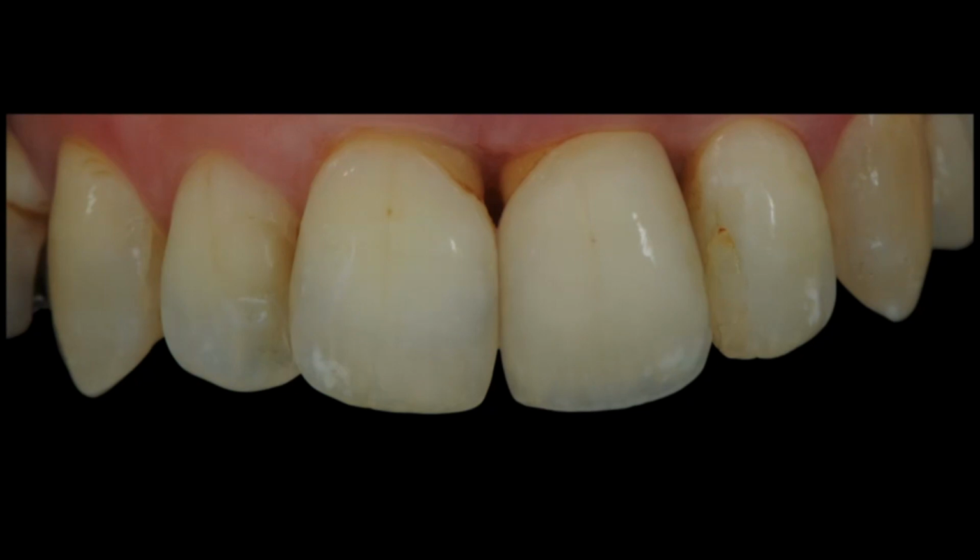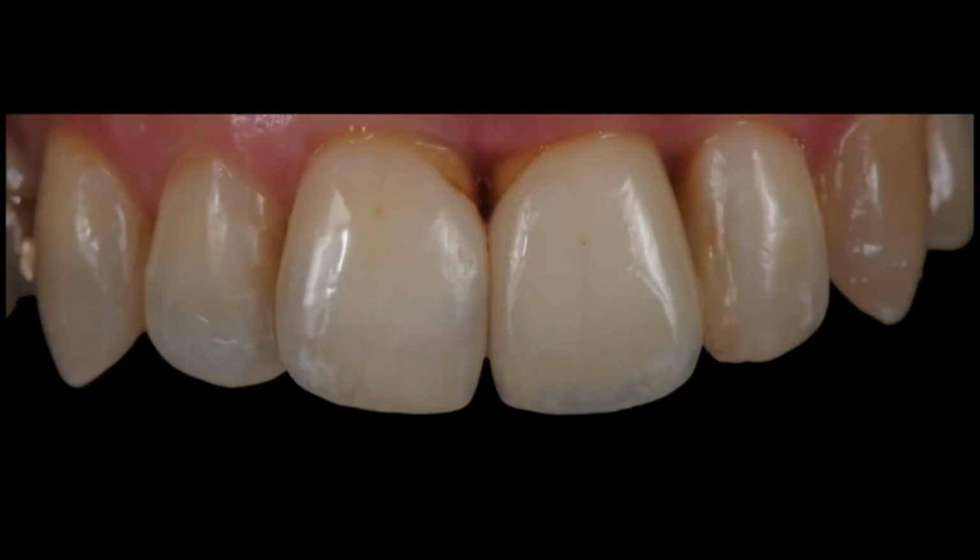And this is what I said in the beginning. This is for me the understanding of high quality in our days by using the material and bring it really up to the limit. And the last picture was taken 2 weeks after, where you see the fillings, they were replaced, and now we were able to close this chapter.